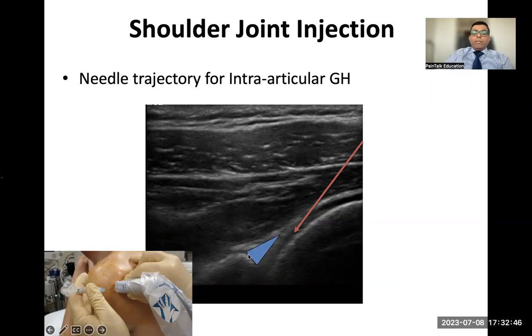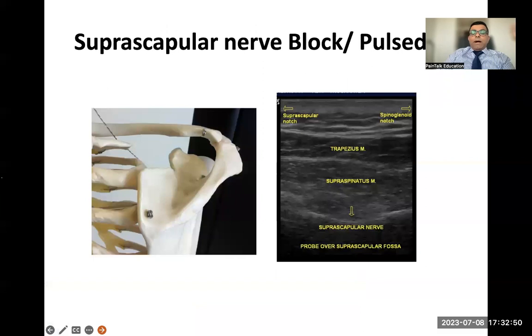The suprascapular nerve block is another very effective injection for chronic shoulder pain. It can also be used for postoperative analgesia following shoulder surgery, and as an alternative to interscalene block in patients with COPD. Place the ultrasound probe on the spine of the scapula and move up to identify the trapezius muscle, supraspinatus muscle, and — deep to the supraspinatus — the suprascapular nerve. Touch the bone with the needle, inject local anesthetic and steroid to bathe the nerve. The same approach is used for pulse radiofrequency.